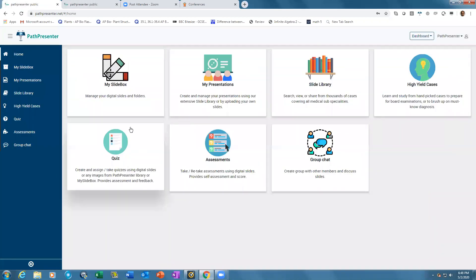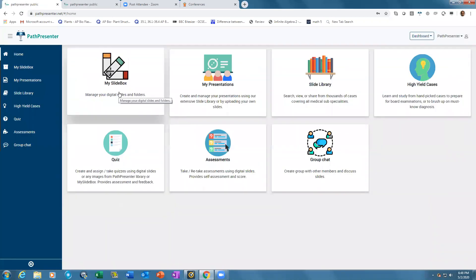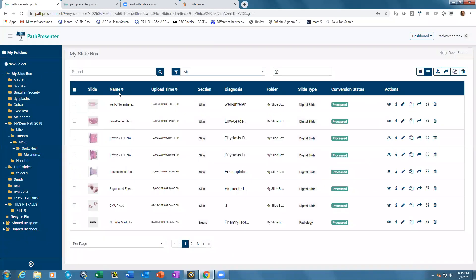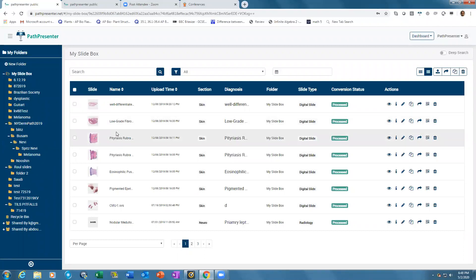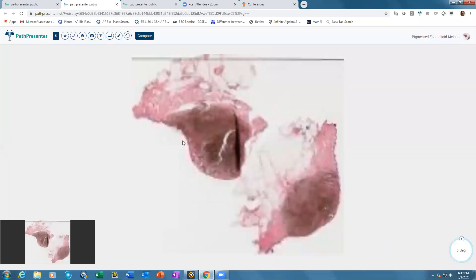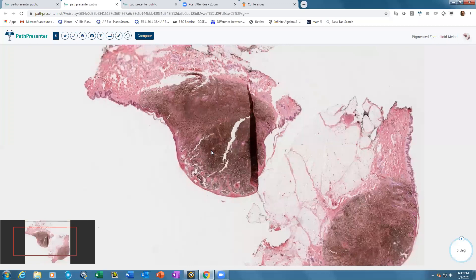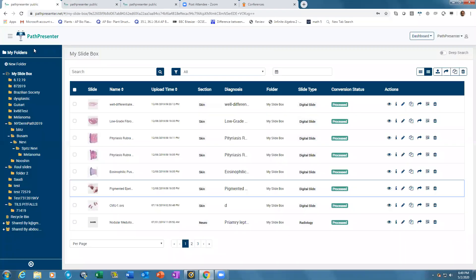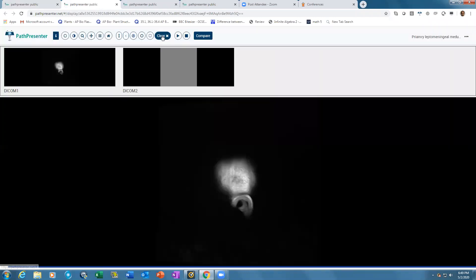My slide box is a file management system on the cloud, like Dropbox or Box with added capabilities for pathology and radiology. It allows you to upload any kind of whole slide image regardless of scanner, any DICOM radiology image, and other file formats like JPG, PNG, MP4 videos. Once uploaded, files remain in your private folder unless you donate them to the library.